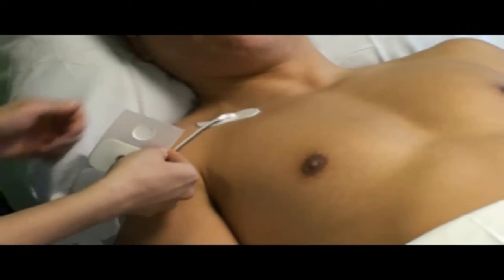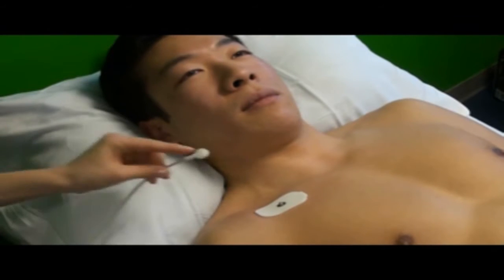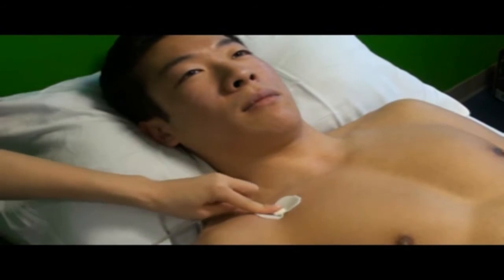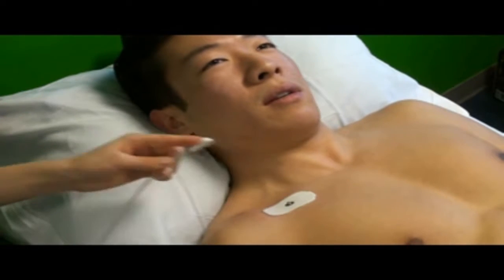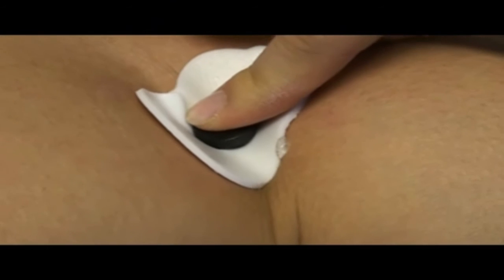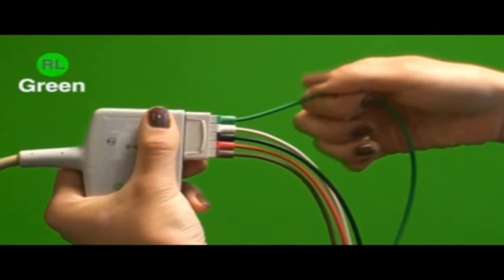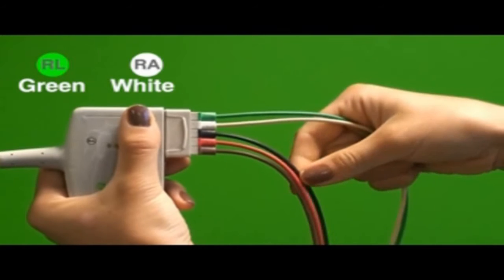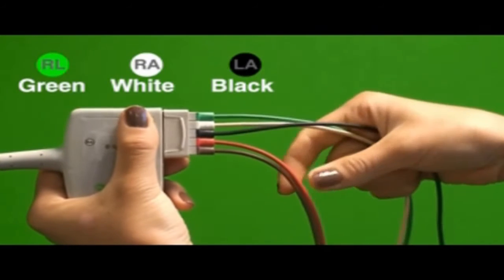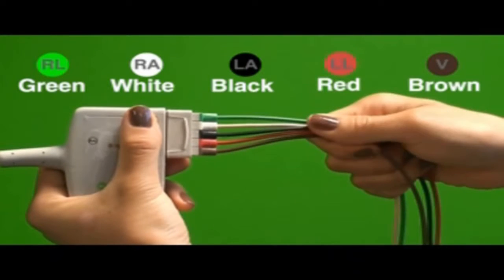the patient's skin. Attaching snap-on lead wires to electrodes after the electrodes have been placed on the skin may require you to apply undue force, which may cause patient discomfort and may cause the conducting gel to spread, making the gel ineffective. Lead wires are standardized according to color, although the color coding is not uniform worldwide. The lead wires shown in this video conform to the color conventions recommended by the American Heart Association.